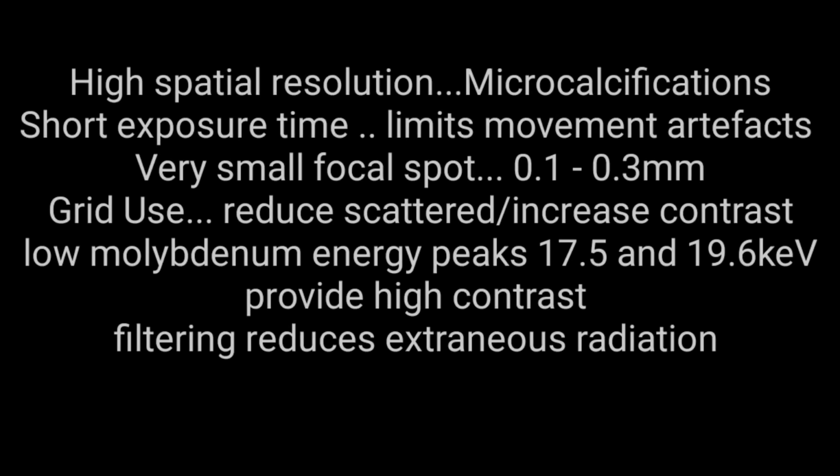And digital mammography requires a very small focal spot, from 0.1 to 0.3 mm, to detect the microcalcifications. A grid is used for scattered radiation reduction.